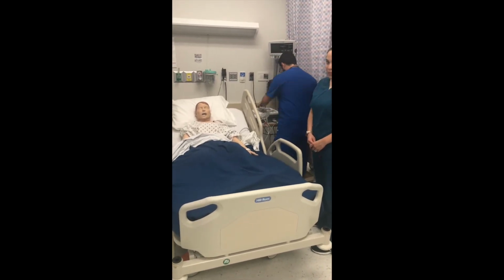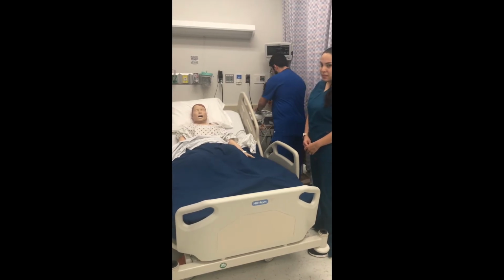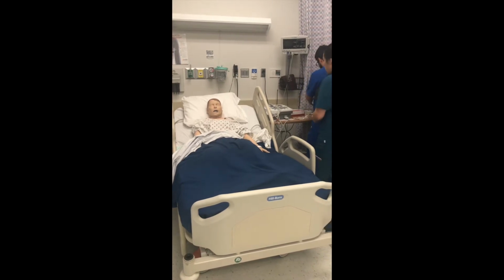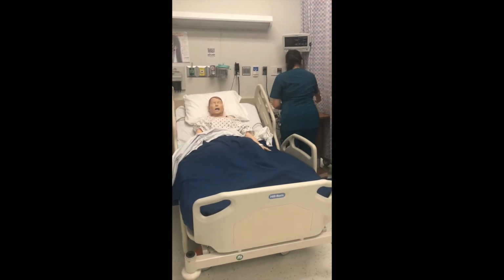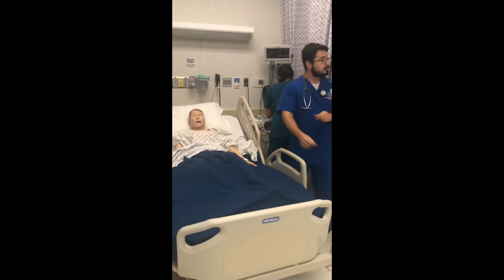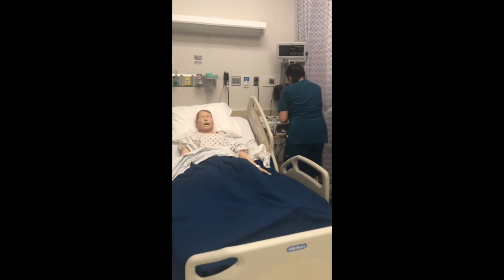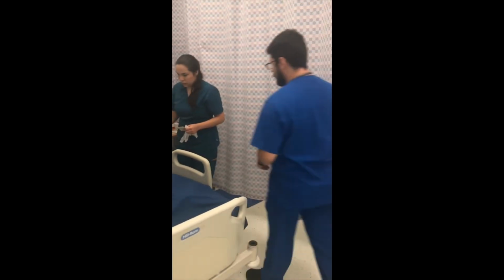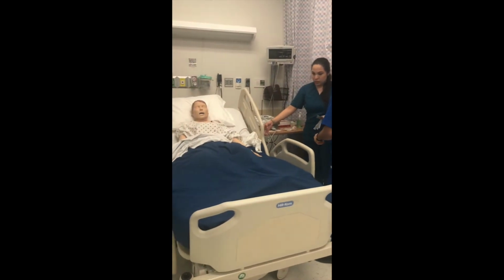Now that the patient's been verified, we want to perform hand hygiene and observe appropriate infection control procedures. We also want to provide patient privacy, provide comfort and safety for patient and self, including raising the bed to appropriate height. Close this curtain, give some privacy. Okay.